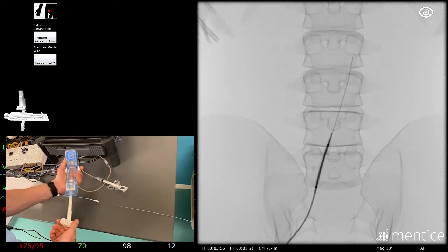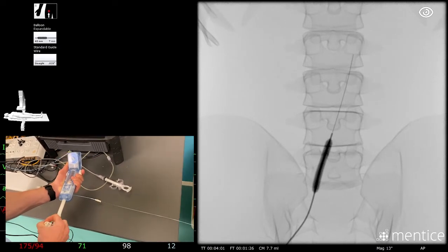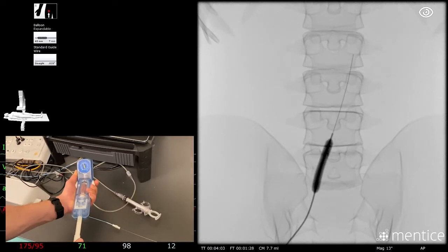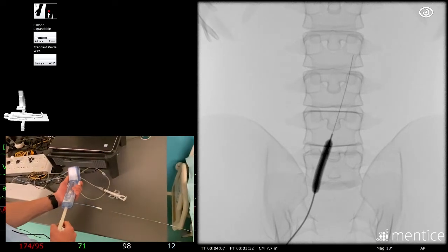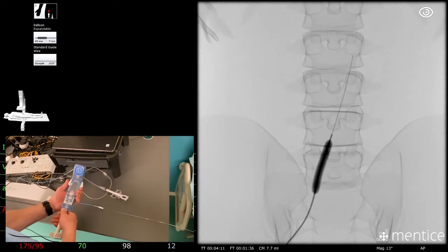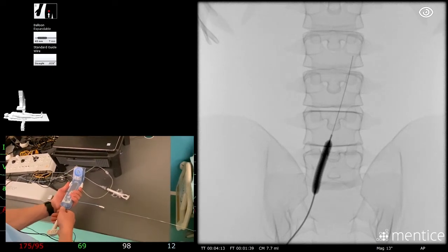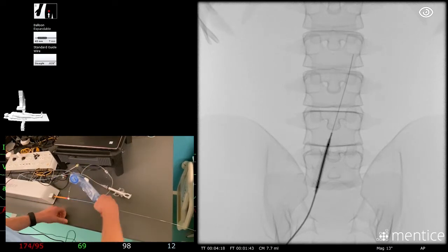It's very simple, just twist it up until I reach my nominal pressure there, leaving it for about 30 seconds, although I'm not going to wait that long in this case, and it doesn't seem to bother the machine that much. So I'm going to deflate it then by clicking these two bits and just releasing.